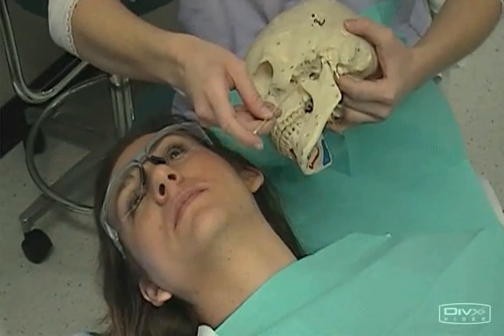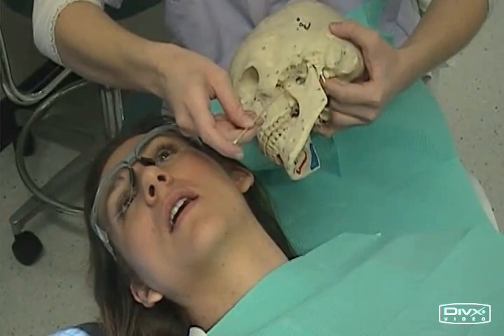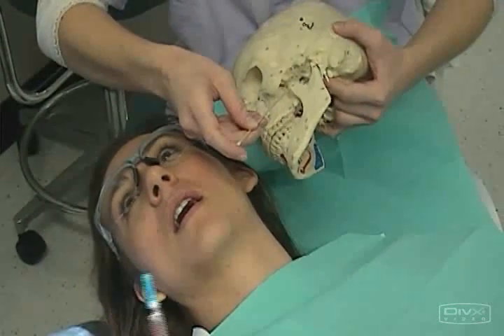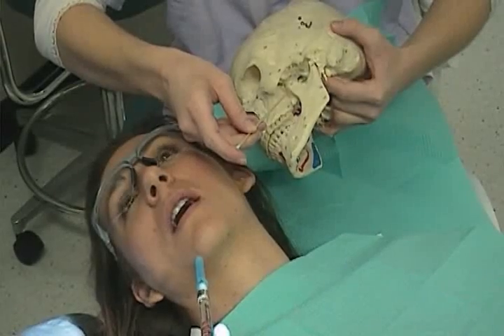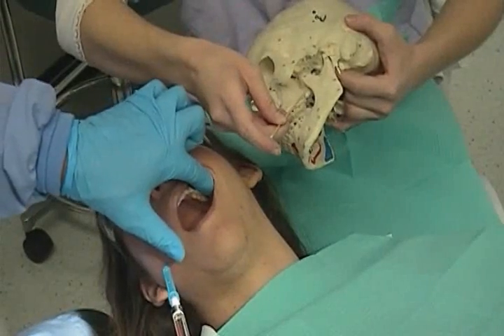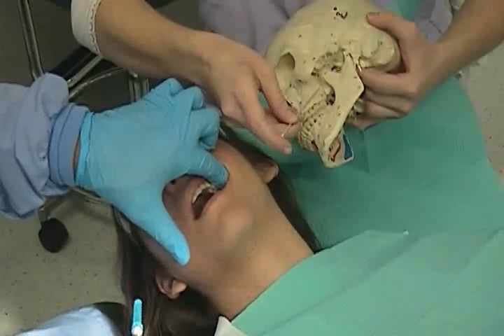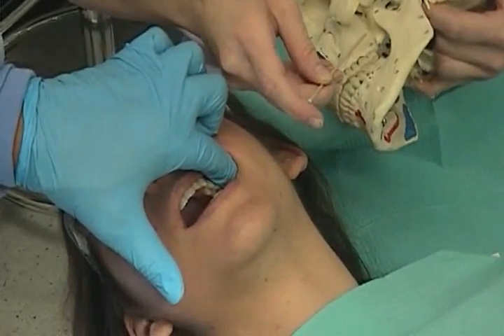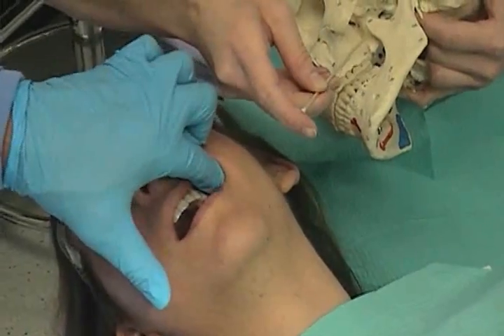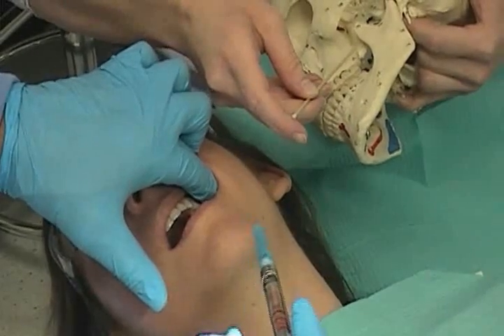What I would like to demonstrate next is the correct approach to the PSA. Often times when a patient has a third molar, it necessitates a more posterior target site for the entrance of the needle. This will necessitate retracting the cheek. Often times the patient will have to close and shift their jaw laterally to the same side that you are doing the injection, which in this case is the left side. This allows more area for you to operate back here, because again, a patient with a third molar requires a more posterior approach.